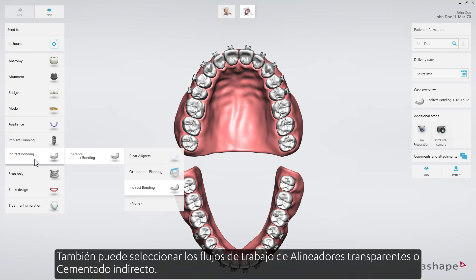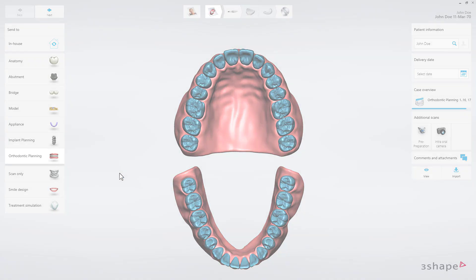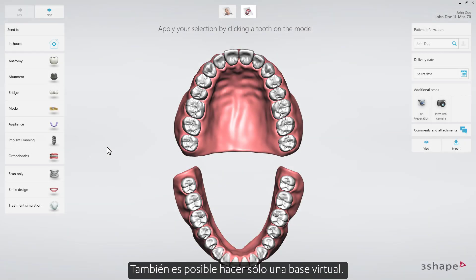You're also able to select Clear Aligners or Indirect Bonding workflows. It is also possible to make just a virtual base.